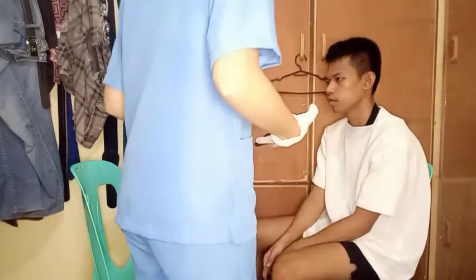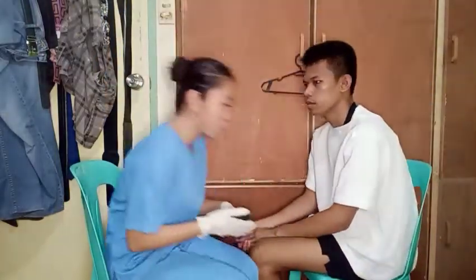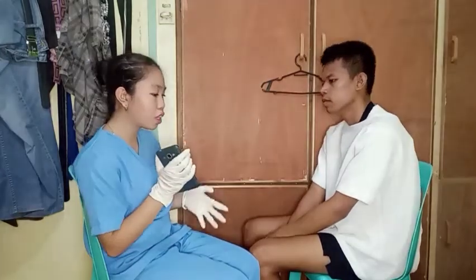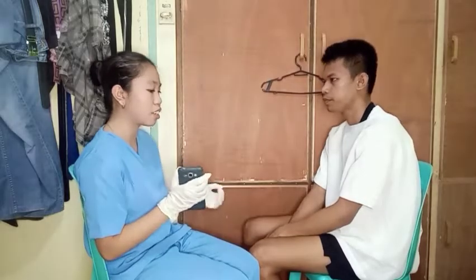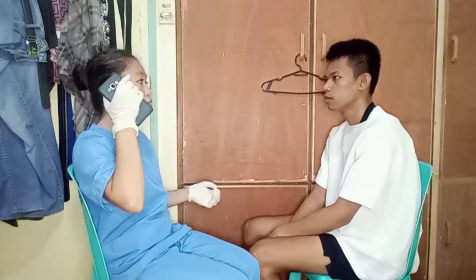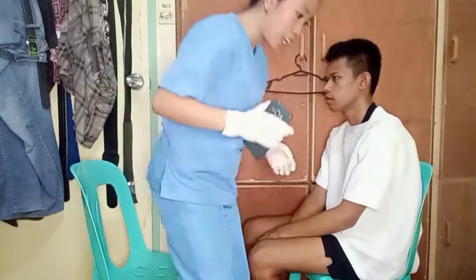Okay, sir. Excuse me. I will repeat my instructions, sir. So we will be doing the same procedure, but with a different location. So I'll be placing this phone on your mastoid process. And when you will not hear anything, say stop, so I can place it quickly to your external ear. And if you cannot hear anything again, you can say stop. Okay, sir? Okay. So we will be performing now, sir.